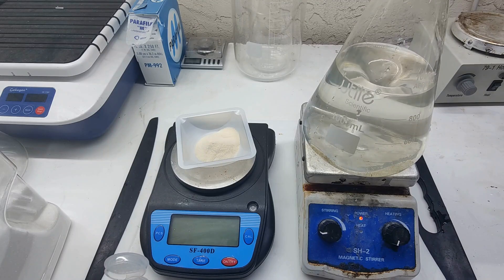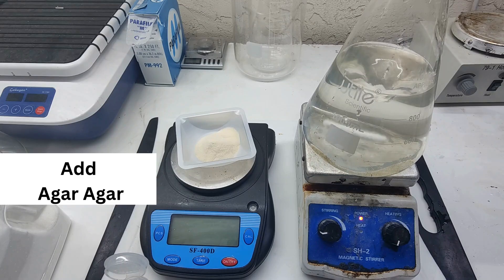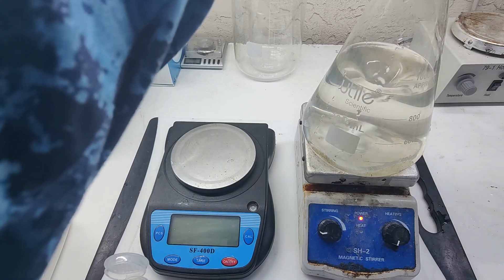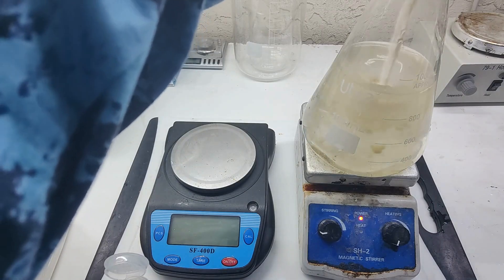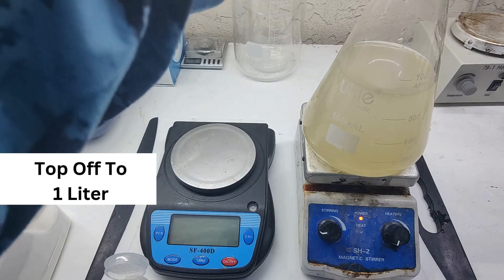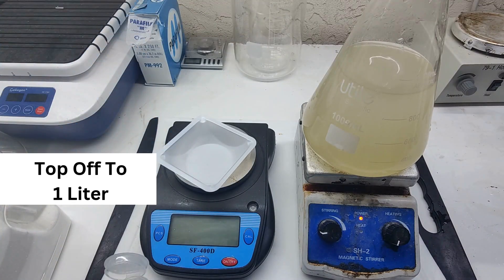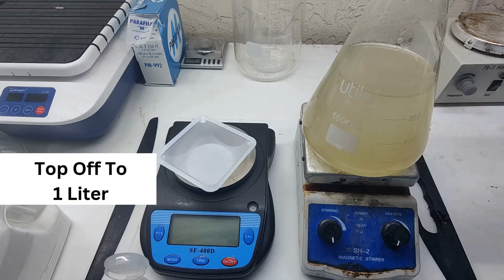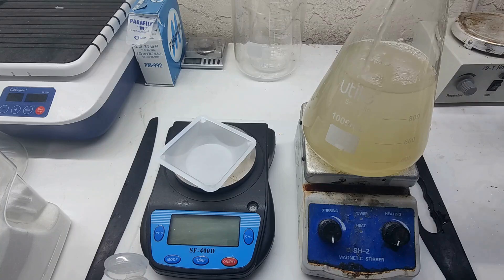Usually the pH will drop about 0.1 to 0.2 during the autoclaving process, so you want it a little bit higher going in and assume it's going to drop a little when you autoclave it. Once you've pH'd it, add your agar and make sure it's mixing and blending well, because agar can get clumpy, so you want to avoid that.